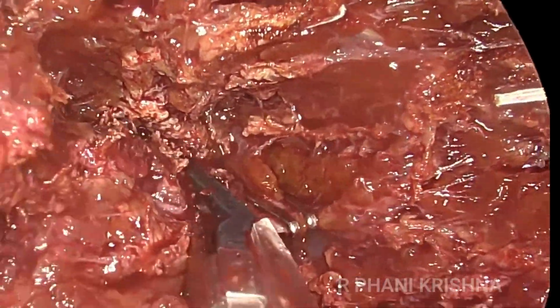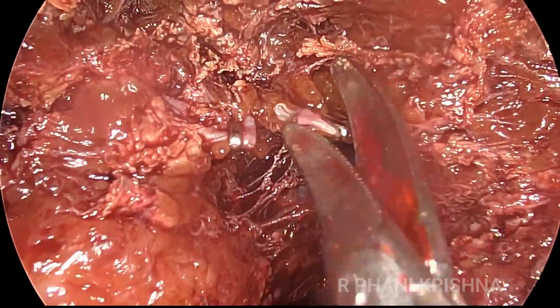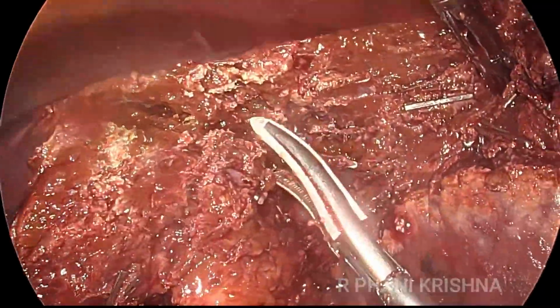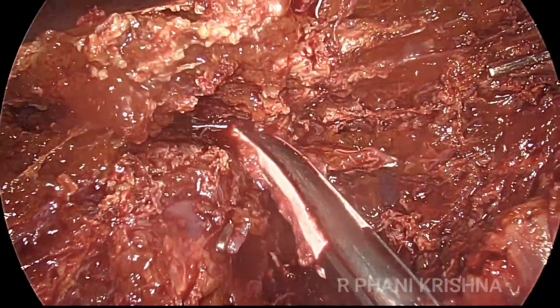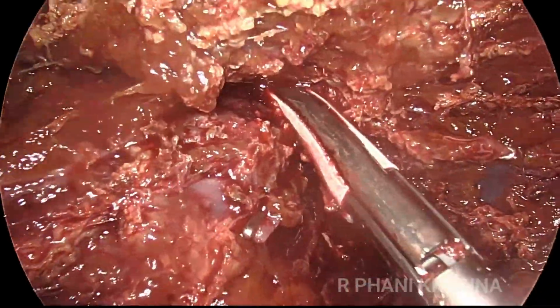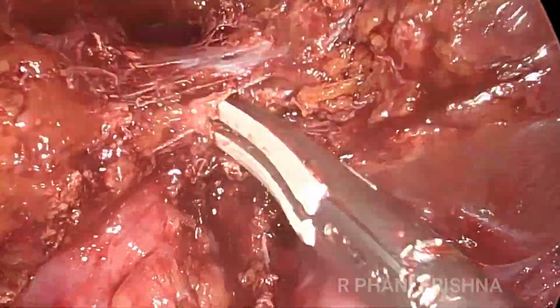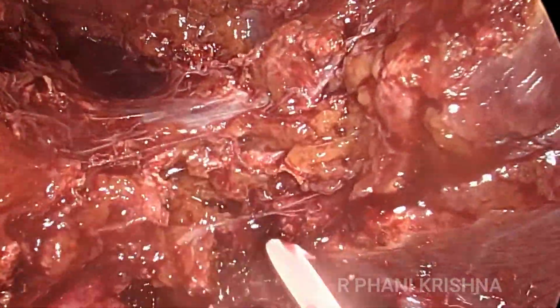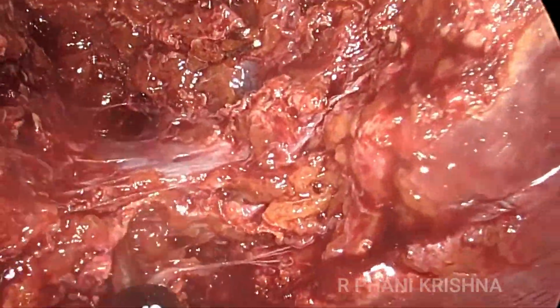So with the CUSA, obviously it's very easy to identify them and dissect them and safely clip and divide them. So mainly in this superior part, you see we are trying to almost go across onto the opposite side for this superior part of the dissection. And again, any venous tributaries which we come across are being doubly clipped and ligated and divided.